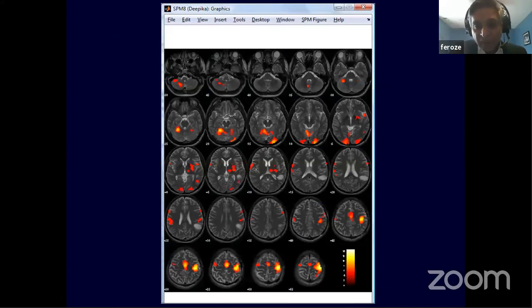Here is an example from the clinics where there's a brain tumor, and again looking for motor cortex. So you can see a nice SMA, motor SMA, and of course this was a unilateral experiment. People come up with various different experiments, and we're looking for one side, on the side of the tumor, and you can present this in many ways.